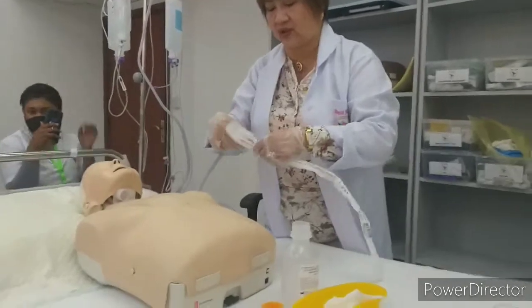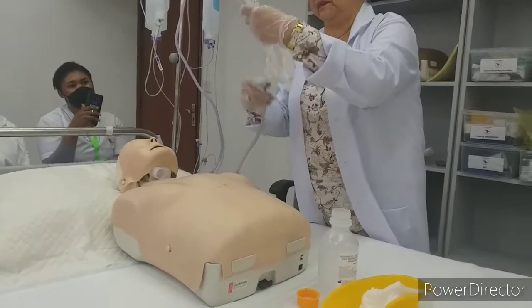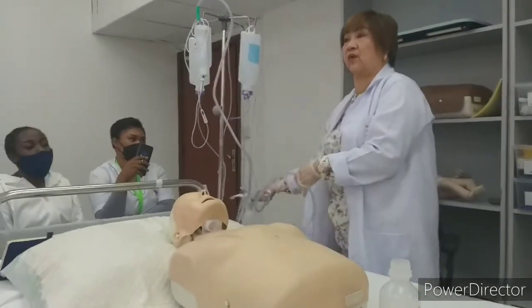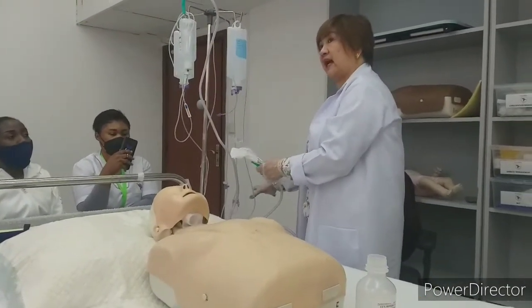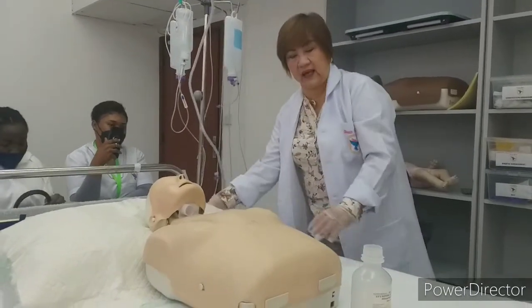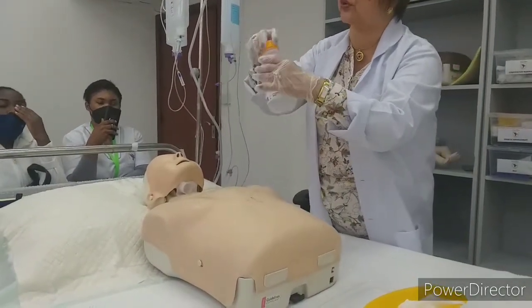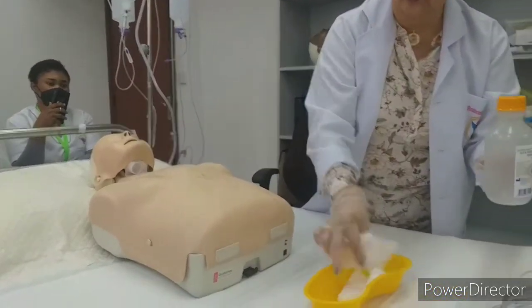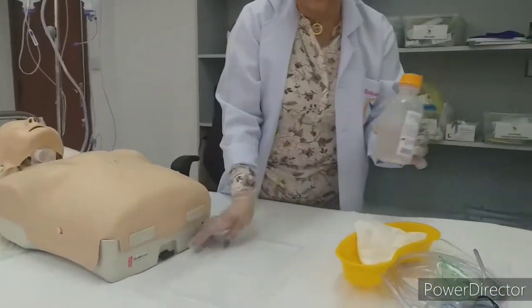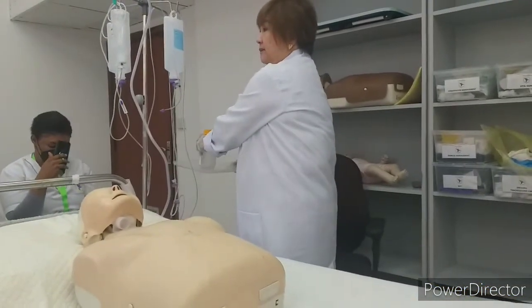And what we need to do here, put it back to the suction pack. So either you put a plaster in here, and this one will go inside of that. There is a cabinet, bedside cabinet, inside of your bedside table. Okay? And the remaining saline solution, you do not throw it. Okay? This all goes to your disposable medical waste. And these two will go on top of your bedside table.